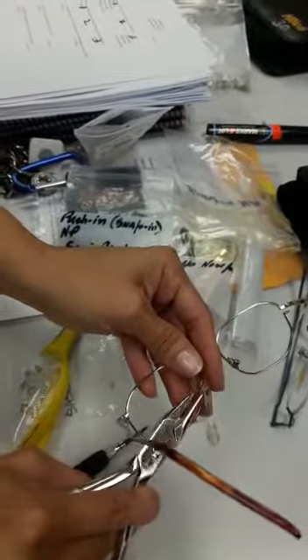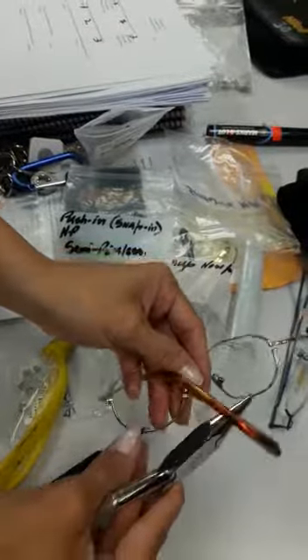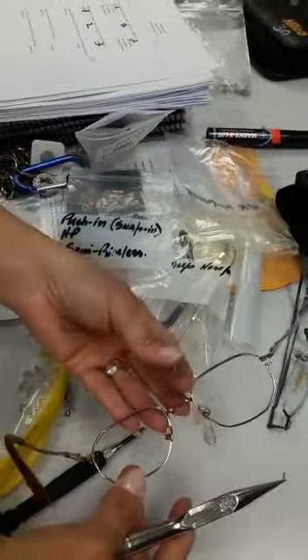Righty-tighty, lefty-loosey. Then you can use your needle nose pad pliers to hold your screw out and you would be able to take it right out.